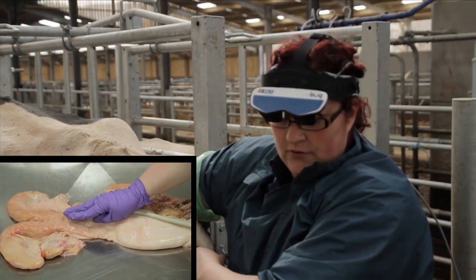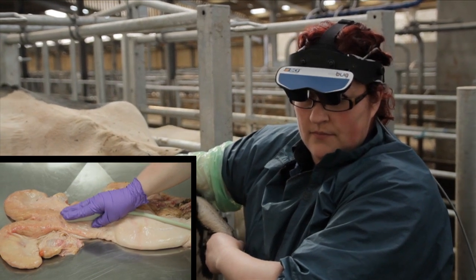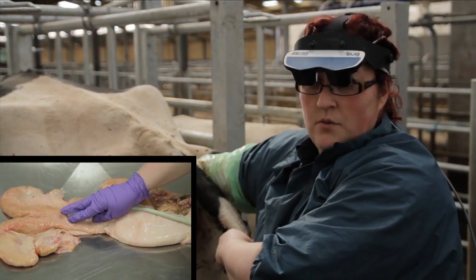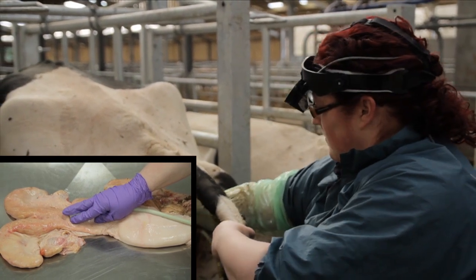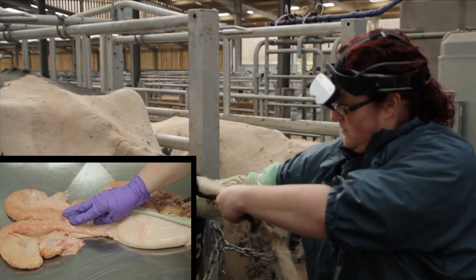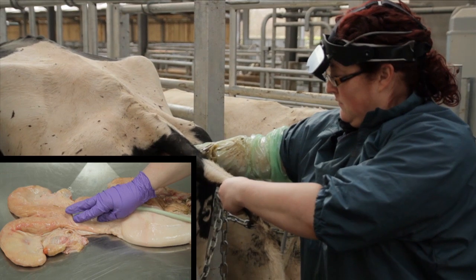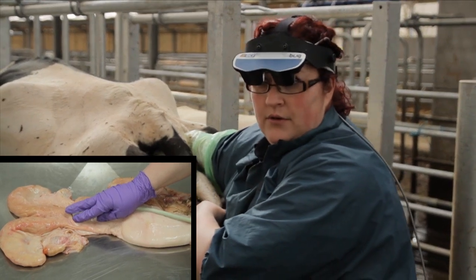We'll again come to the cervical region. We can retract the uterus into the pelvic canal if need be. We don't need to do that in this particular cow. They do begin to strain. Just allow it to pass until they relax. And then gently proceed inwards.